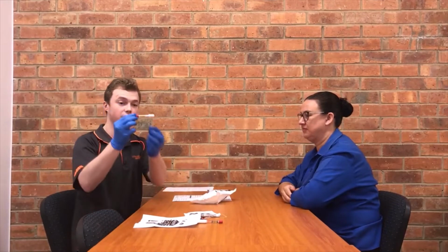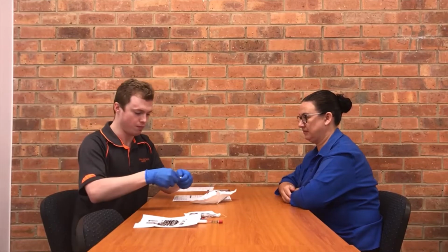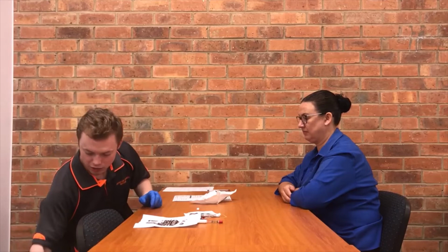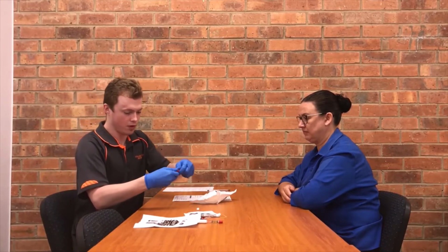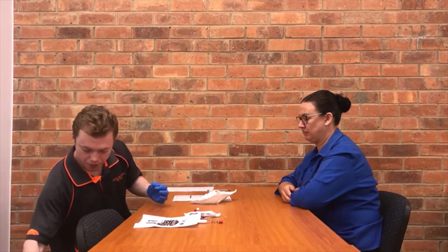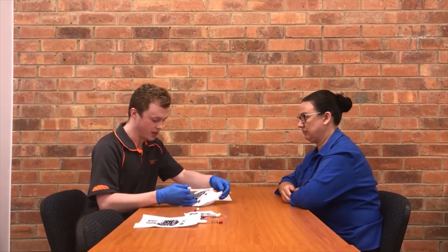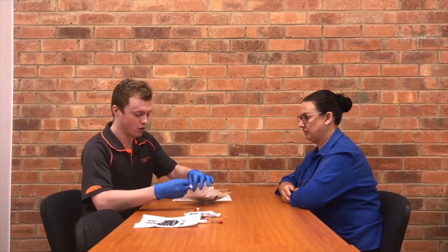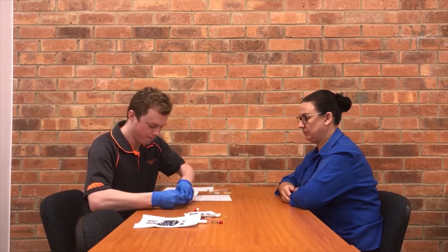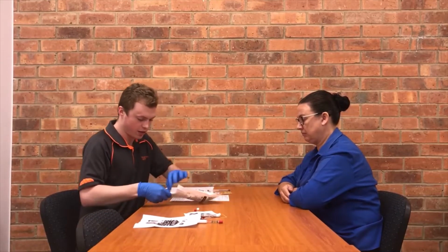Now you snap off the 2 caps on the red and the white side. So a bit harsh there. And just dispose of them in the bin. Other side. Wonderful. Got the test. And you insert the white end into, there we are. Again, quite forceful, make sure it's all the way in there, no air escaping.